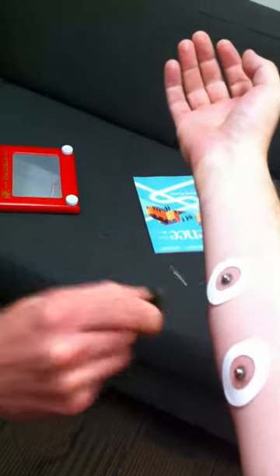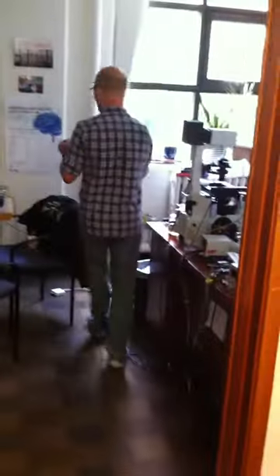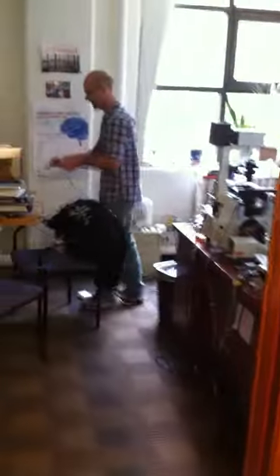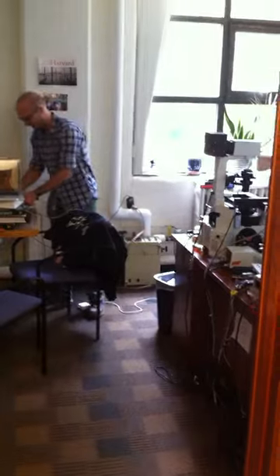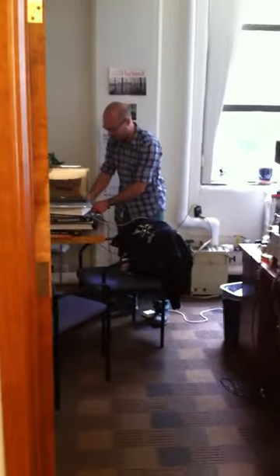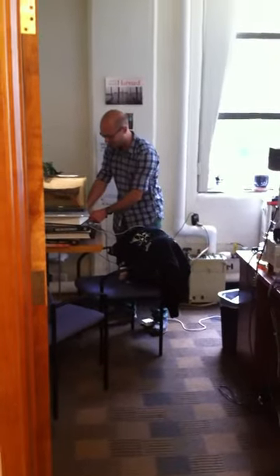Wow! Pretty neat, huh? Yes. Thank you Dr. Ryan Draft for experimenting on me. Now you can safely experiment on students. Chinese high school students.